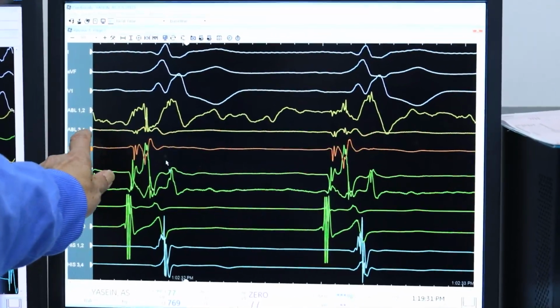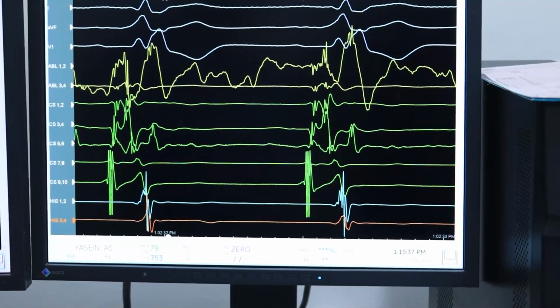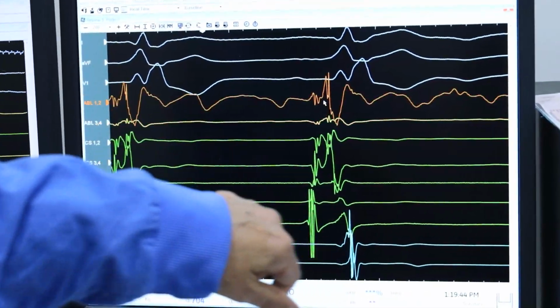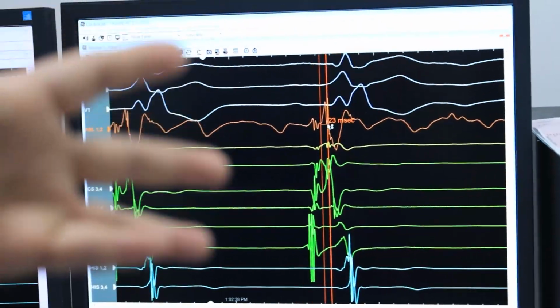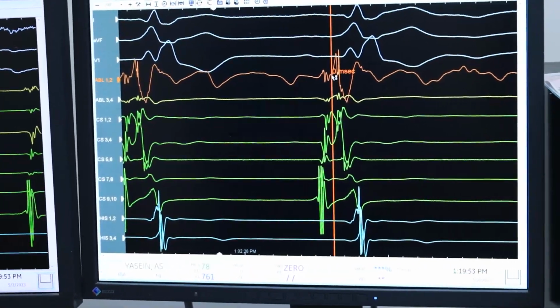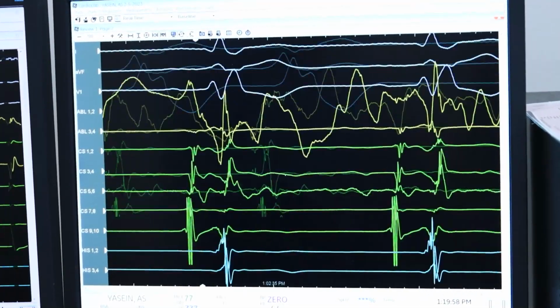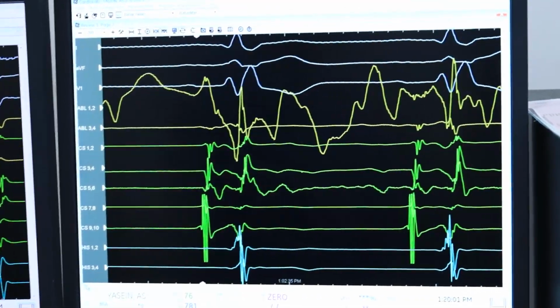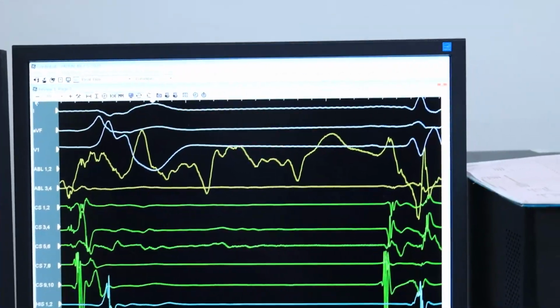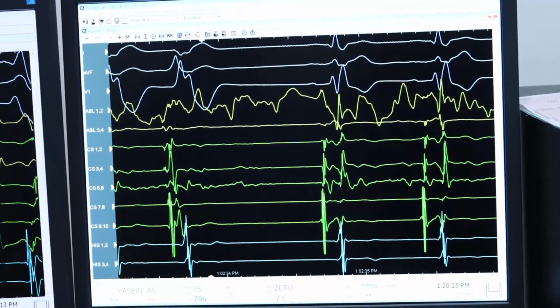Look at this. If we increase the size more of the ablation 1 and 2. Please. Can you give before ablation? So look, it is a negative delta in V2. Now we have a right bundle, so the more pre-excitation will be on the left side. This is okay, it is 23, but it's very good compared to CS 1 and 2. Ablation here immediately, and we gave 50 watts for 2 minutes. The same here, pre-excitation normal with this right bundle.